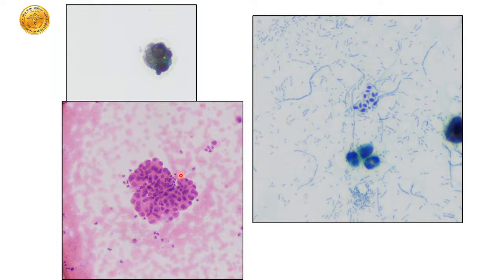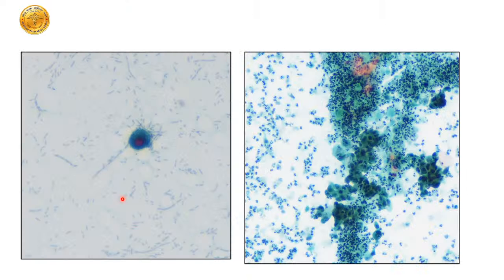And this we call a benign tissue fragment, but this turned out to be something else. This was from a voided urine. These were infrequent, with some neutrophils and a lot of blood in the background. So I'll just show you what this turned out to be. Can I have the next slide, please?